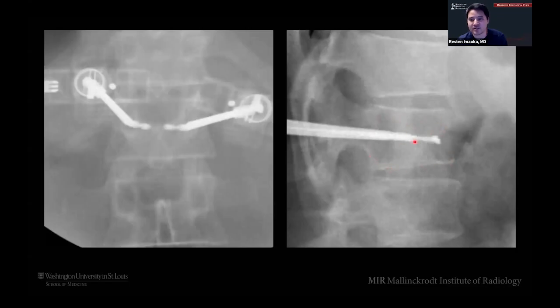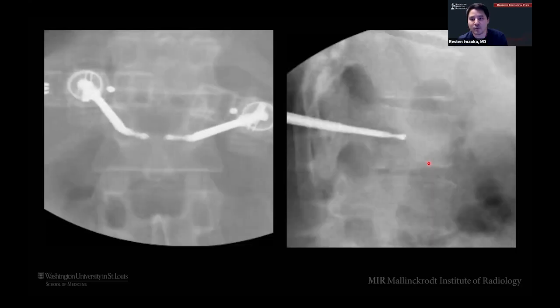So we're going to center one ablation zone up front, where the center is right here, and we're going to get an ablated portion of the anterior vertebral body here. Then what we're going to do is pull that back and do the same thing, right? And so now we've centered our ablation zone in the posterior vertebral body. We're still about a spinous process apart because these ablation probes can curve and we can steer them to where we want. But this ensures that you're going to ablate the entire vertebral body.